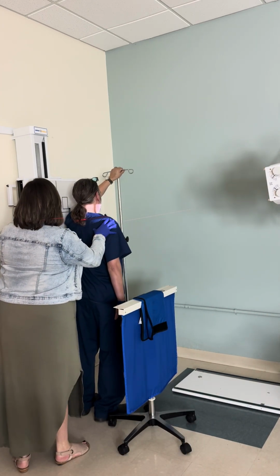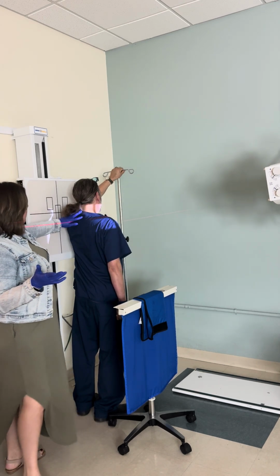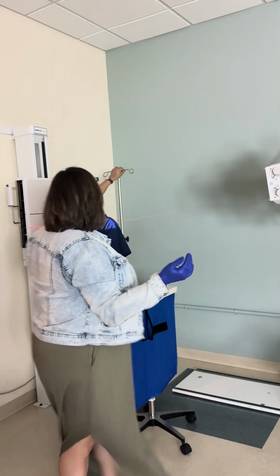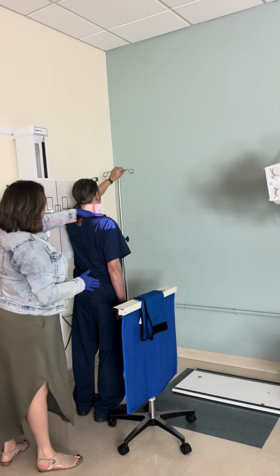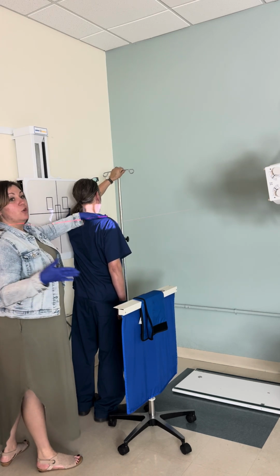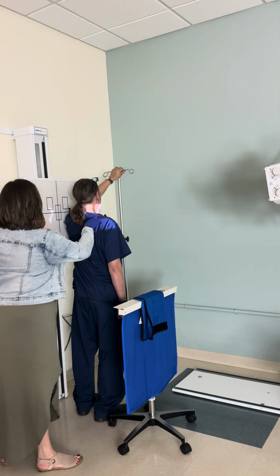So go ahead and scooch forward for me just a little bit. And our center here is C7, okay? So what I like to do, C7, we can feel that vertebral prominence on the back of our patient. But as long as we're centered to like where we're skimming on the top of the shoulder, where the shoulder and neck meet, you'll be at C7. Does that make sense? So my line is right about here.